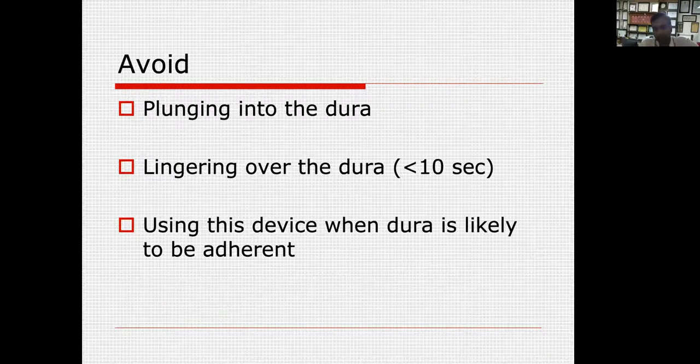So we take bone graft using this ultrasonic scalpel. One has to avoid plunging into the dura because if there is undue force on the dura, it can damage the dura. One should avoid lingering over the dura for more than 10 seconds. And one has to be very careful when using this device when the dura is likely to be adherent. There are techniques, I'm sure we can discuss them. When the dura is adherent, you have to use this device very carefully.